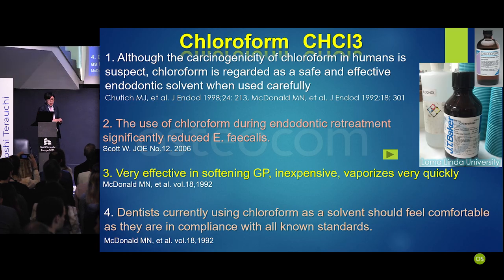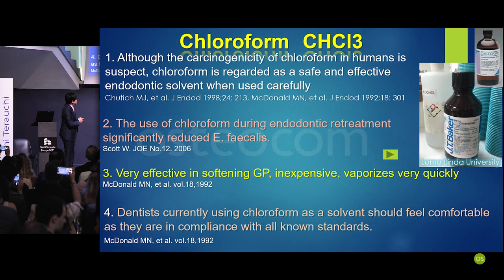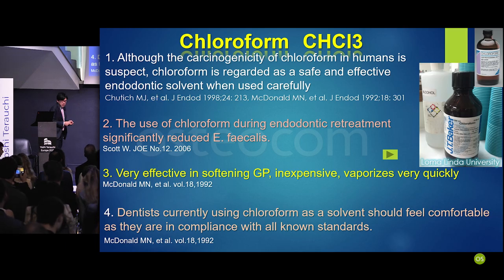In addition to that, I use chloroform. Many people are concerned about the carcinogenicity of chloroform, but it's okay. Many studies support that. Although the carcinogenicity of chloroform in humans is suspected, chloroform is regarded as a safe and effective endodontic solvent when used carefully. Actually, I use it every day. I use it in every case, in all the cases in retreatment.